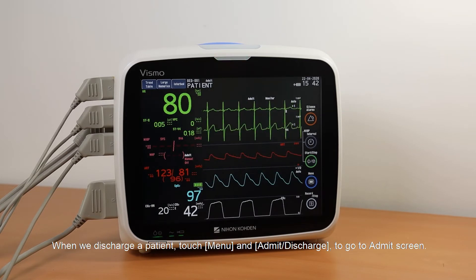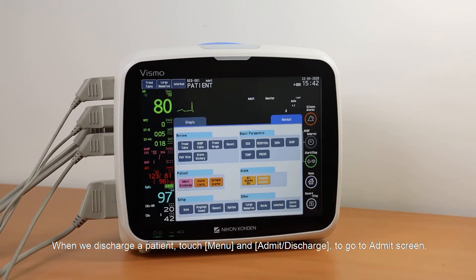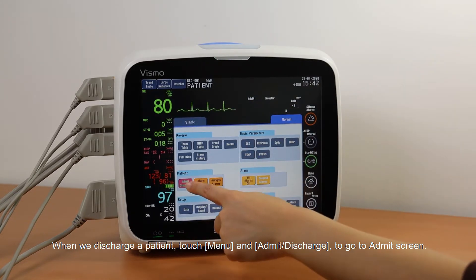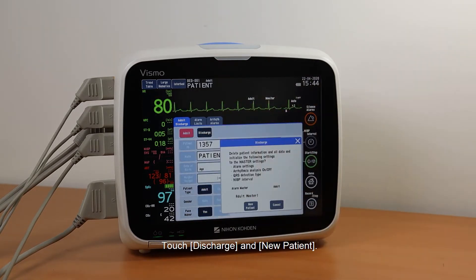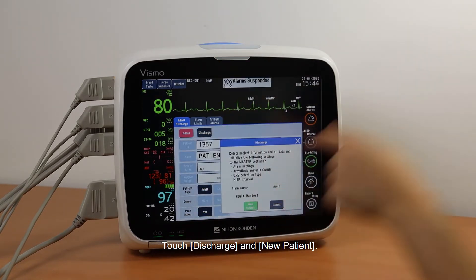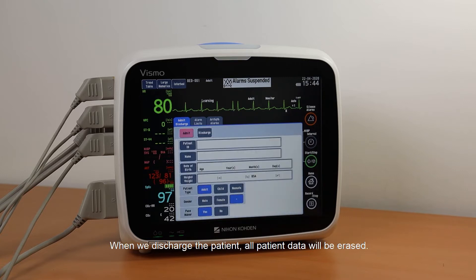When we discharge a patient, touch Menu and Admit/Discharge to go to the Admit screen. Touch Discharge and New Patient. When we discharge the patient, all patient data will be erased.